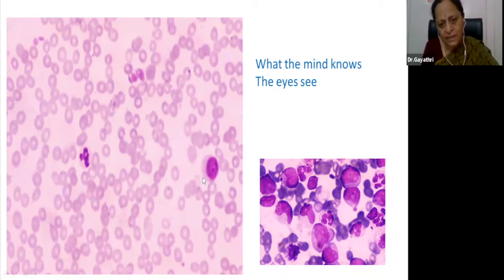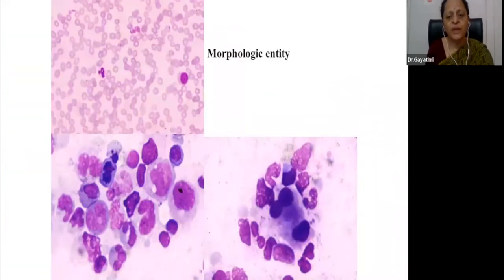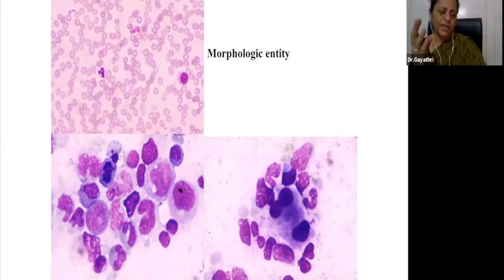And look at this cell. Is this a lymphocyte? Is it a monocyte? Again, an atypical agranulocyte. So you have a beautiful combination in this one field that gives you a diagnosis. You should not miss it. And this one definitely requires marrow aspiration and marrow biopsy to identify these dyspoietic granulocytes and, in this case, prominent blasts, thus giving you a diagnosis that is a classic morphologic entity.